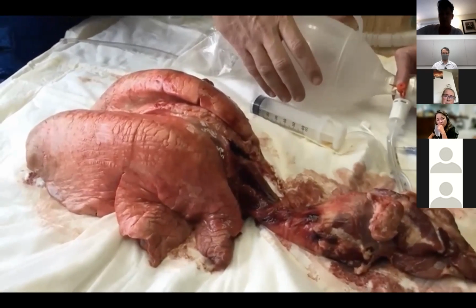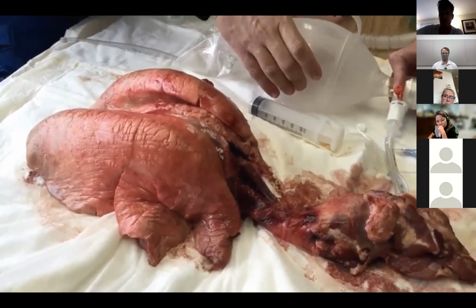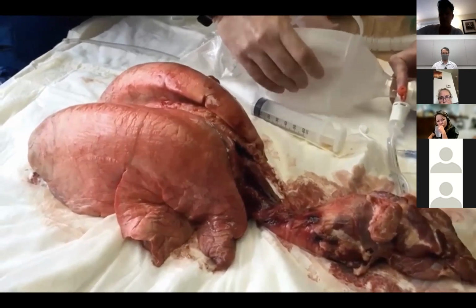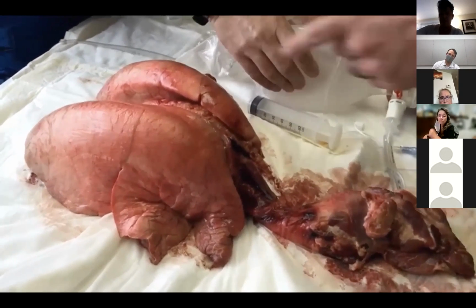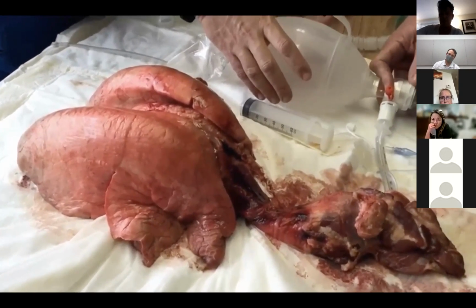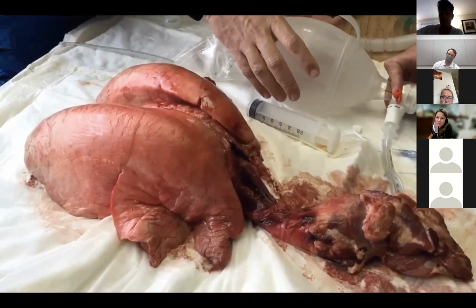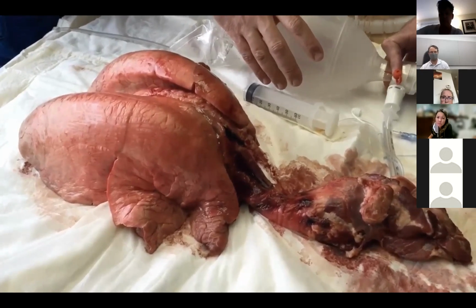So you can see that's our physiologic norm. That's almost like not having the PEEP going on at all. So that's 5. You can just cruise this up to 10. And now we'll get more functional reserve volume. We got more tidal volume now going on. We're recruiting tens of thousands of alveoli. There's 15. We're starting to just get into that bagging noise, and then there's 20.